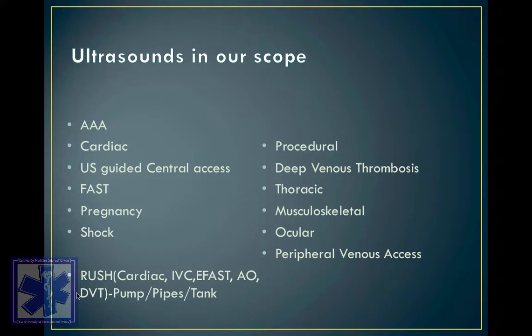And then you've got your RUSH study, which is a giant conglomeration of different studies in someone who's hypotensive, to kind of work up why they are hypotensive in the ED.